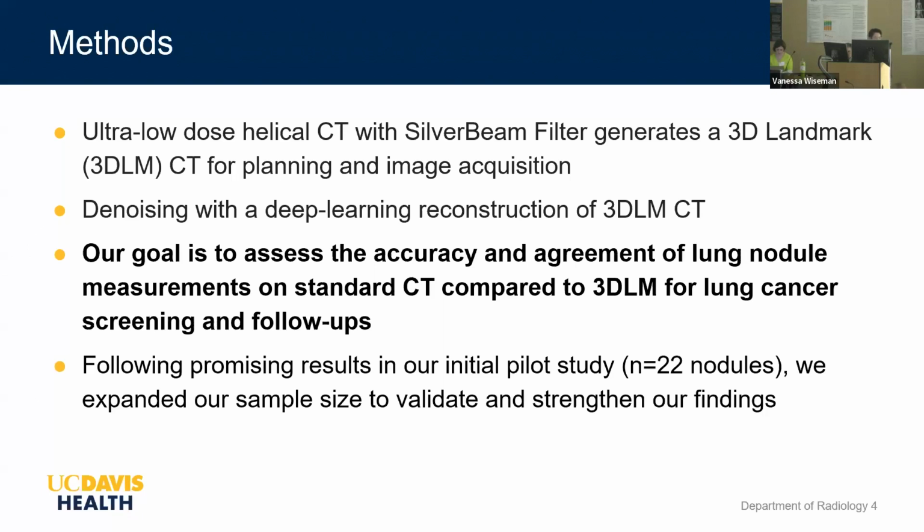And the purpose of this is to really assess the accuracy and the agreement of lung nodule measurements on standard CT compared to our reconstructed 3D landmark scans for possible lung cancer screening and nodule follow-up. And this was really following the promising results of an initial pilot study where we had 22 nodules measured, and we really expanded our sample size to validate and strengthen our findings.